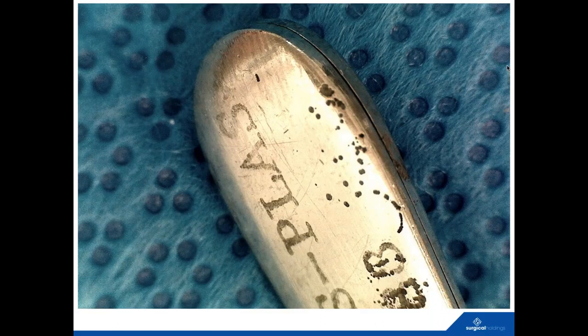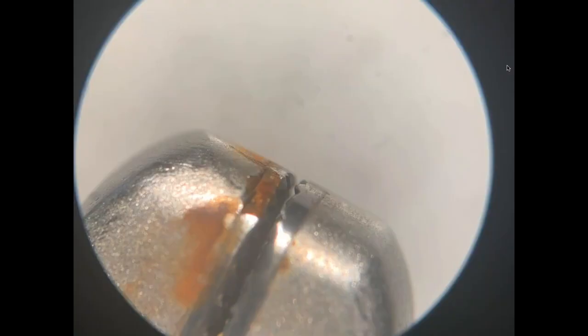It's very important that these instruments are found and removed from the sets because, like you said, they absolutely cannot be cleaned. I often refer to it kind of as the iceberg. We see that small portion that sticks out of the water, but we don't see the larger piece that's underneath. And same with that stainless steel. We don't know how deep and how far the damage is in those pits. And so it literally makes them impossible to clean.